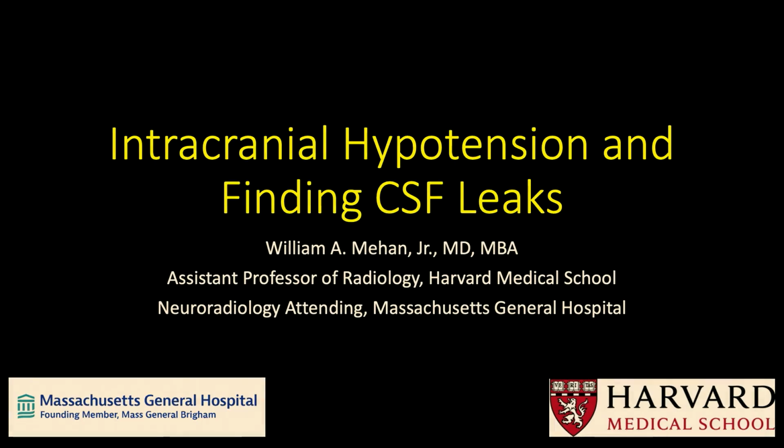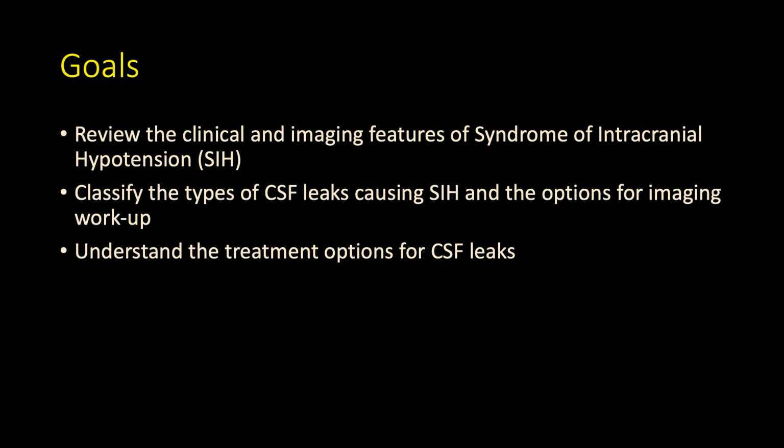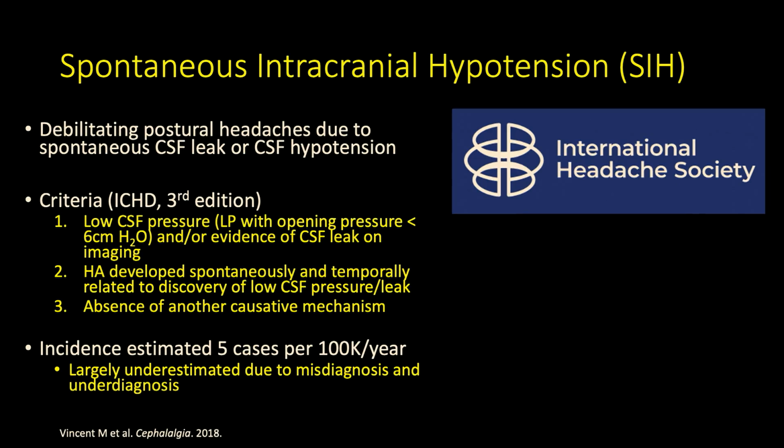Okay, so we're going to be talking about CSF leaks. Our goal here is to review the clinical and imaging features of SIH, or syndrome of intracranial hypotension, and we'll classify the three major types of CSF leaks and the options for imaging workup. And then at the end, I'll go over some of the treatment options for these disorders.